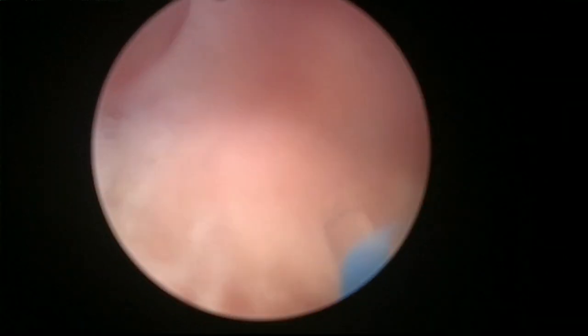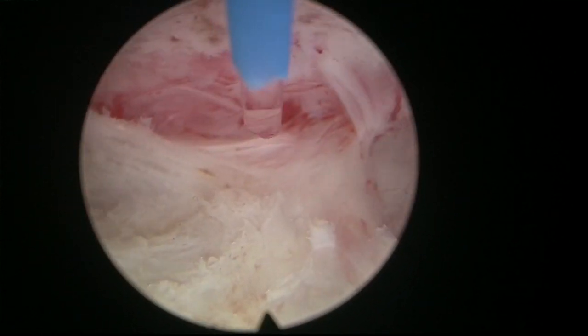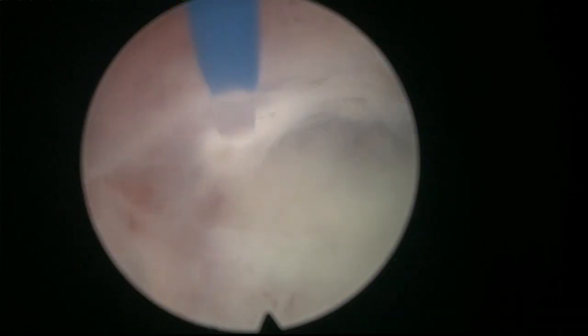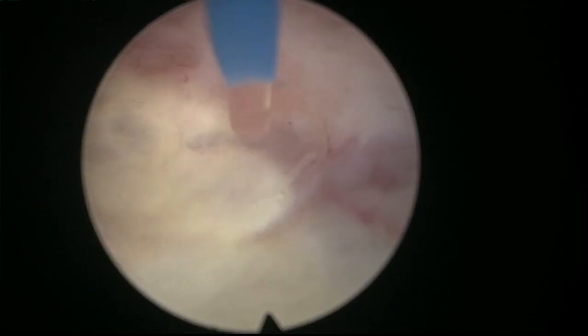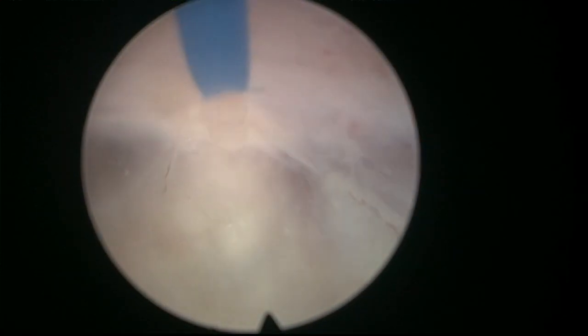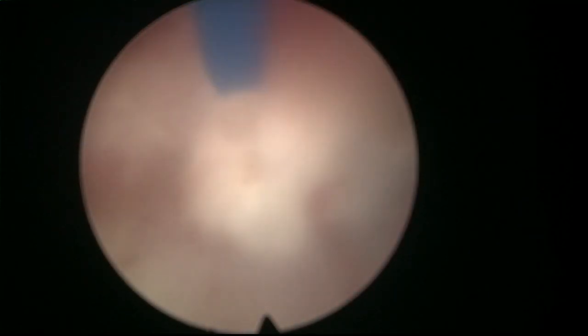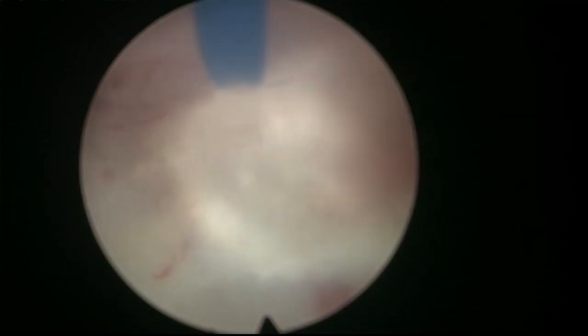so that's the posterior plane. I'm going to put the fiber at 12 o'clock, and I'm going to follow the dissection a little bit further. Of course, if the bleeding continues, I will try to do some hemostasis before progressing. But here you can see that I'm developing the posterior plane, trying to split the screen in two, trying to keep the line of dissection in the middle of the screen. And at the beginning of the procedure, my aim is going to be to stay against the line.